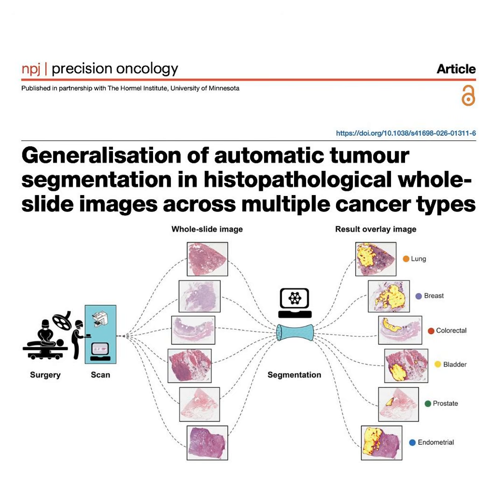Right. But here is the real kicker. How closely did the AI agree with pathologist MP? The AI agreed with him 88% of the time. Which is incredibly close to his own 91%. It really is. And to put that 88% into perspective, they had the second human doctor, pathologist LV, annotate the exact same slides. Yeah. Pathologist LV only agreed with pathologist MP 77% of the time.